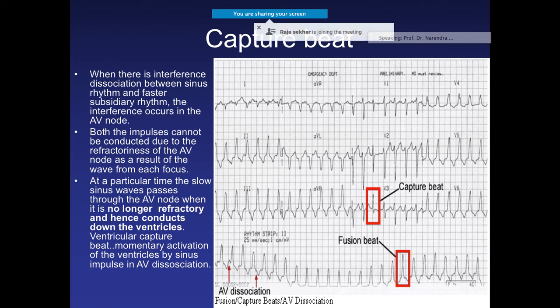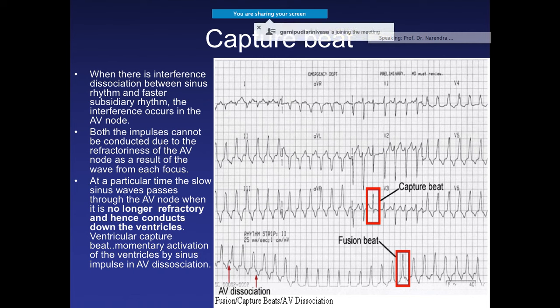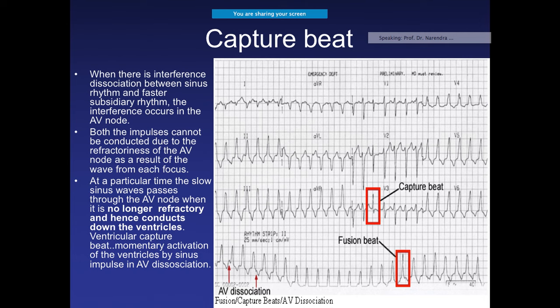Other ECG signs that confirm VT include the capture beat and the fusion beat. A capture beat occurs because in VT there is AV dissociation, but occasionally the sinus wave passes through the AV node when it is no longer refractory and conducts down the ventricle, producing a narrow beat — this is the capture beat. It is identified because it will be narrow compared to the wide VT complexes.